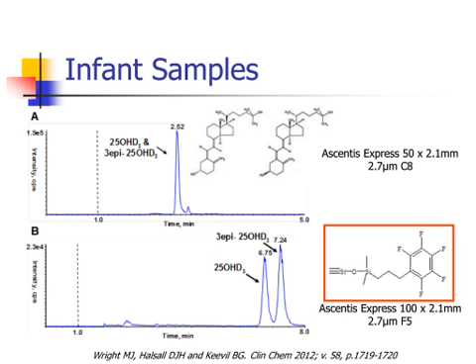So we generally had a 2-stage process where we would measure all of our adults with the top method, and then we would run a second method for all of the infants. And that's not particularly ideal, especially when you might get a transcription error and an infant sample might go through the wrong method.